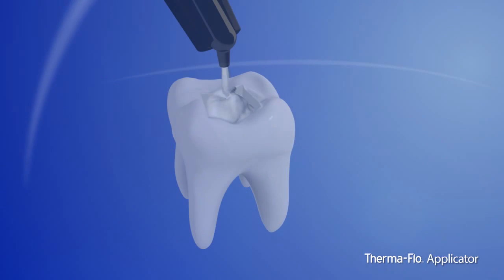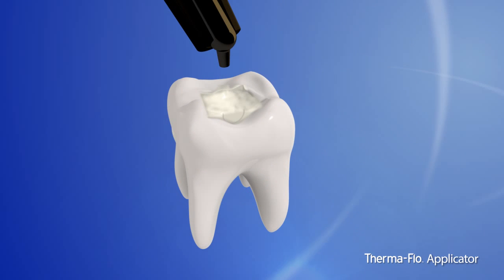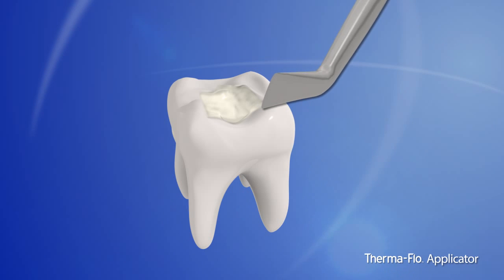With the applicator, you can now reduce incremental layering of composite in challenging posterior restorations. Experience superior composite adaptation to cavity walls, improving the quality and efficiency of your restoration.